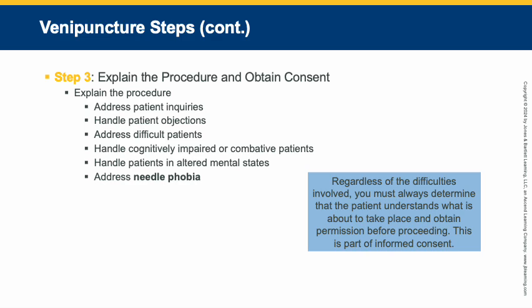When performing venipuncture on every patient, always have a gauze pad ready, but also be prepared to release the tourniquet quickly in case the patient pulls the needle out or suddenly jerks, causing it to bleed out. If the needle penetrates deep in the arm, inform the patient's nurse or other healthcare provider and document the incident according to the facility protocol.